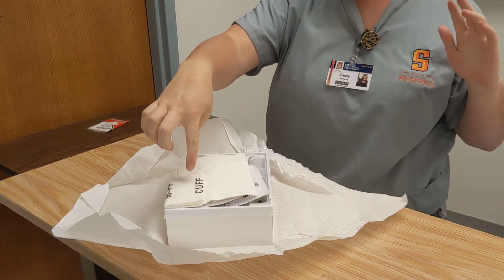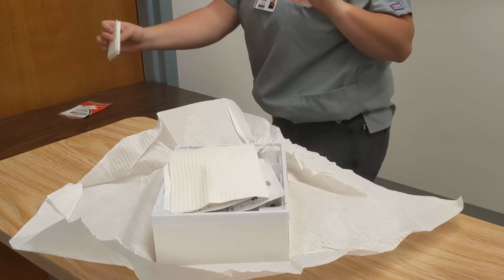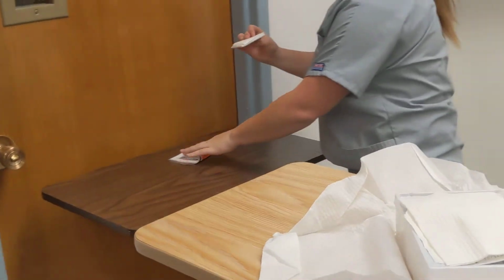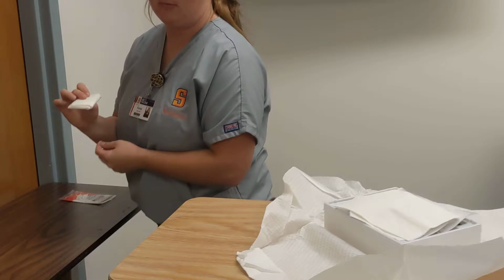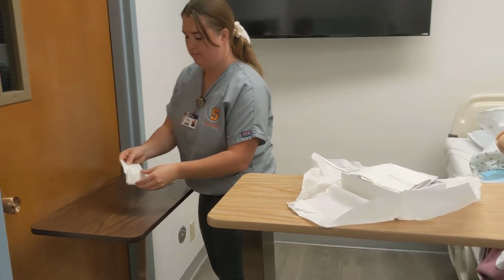Okay, so this is what I'm using. And I'm gonna come over to this table so that I do not touch our sterile film. So I'm gonna open it up.